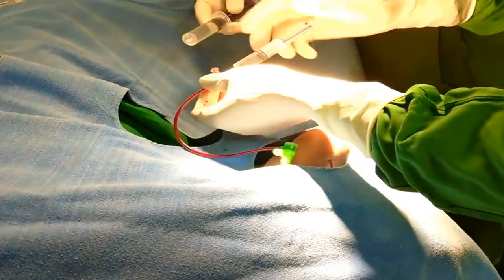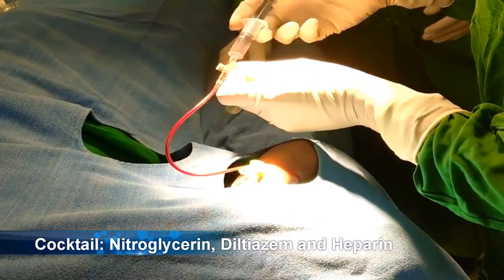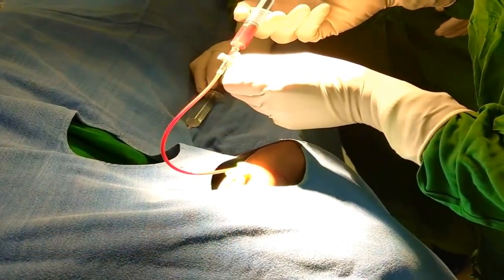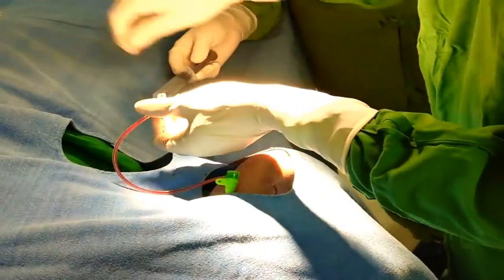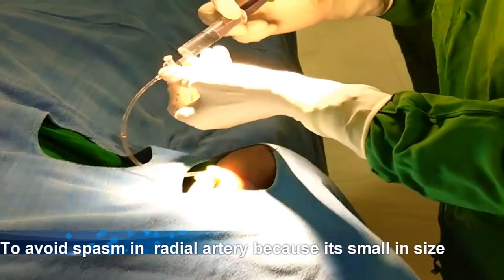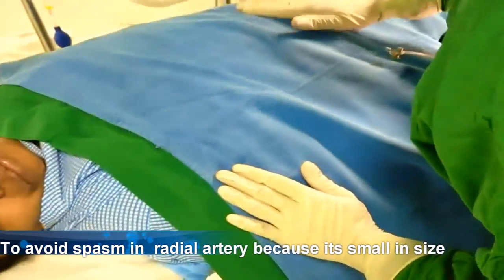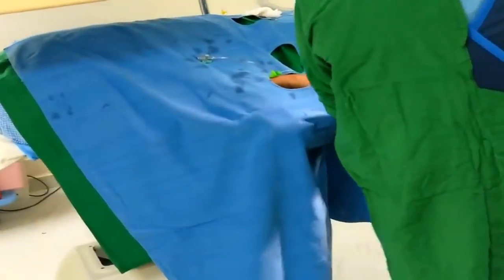After that, we give a cocktail — that means diltiazem, nitroglycerin, and heparin. These three drugs in combination are called the radial procedure cocktail. The purpose of this cocktail is to relieve spasm in the radial artery before, during, and after the procedure.